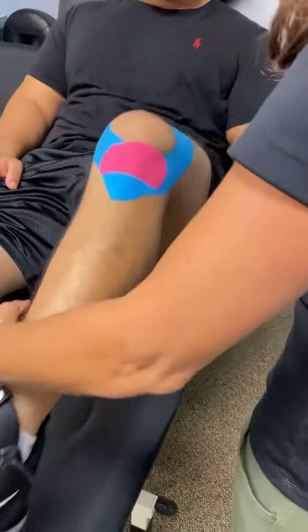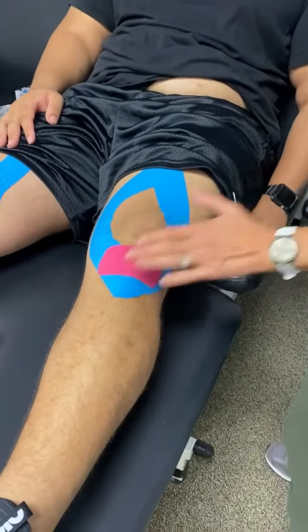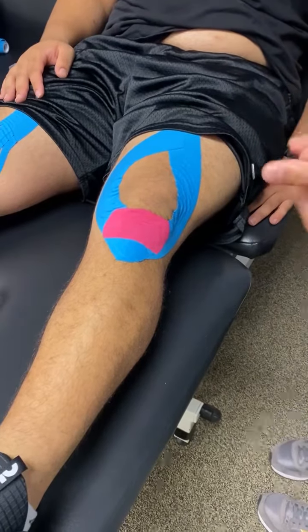Go ahead and straighten that knee up. That's what it would look like with a straight knee, and this can be used during any functional activity, worn in water — works really well and stays on really well. That's the quad taping.